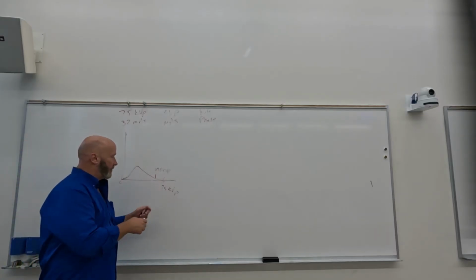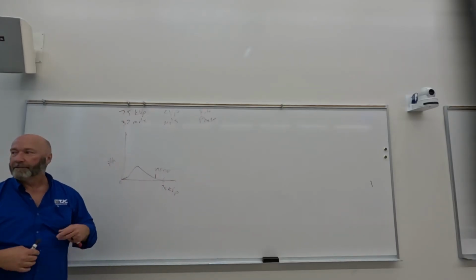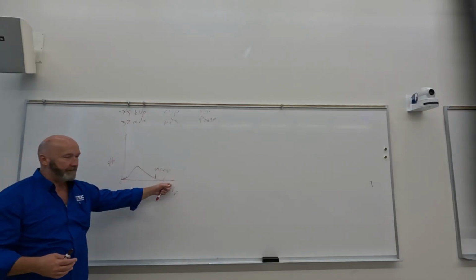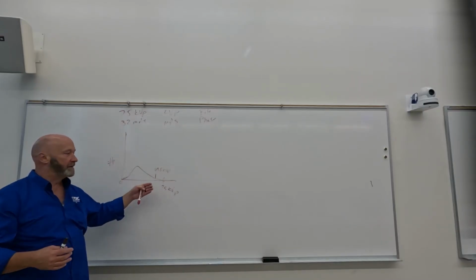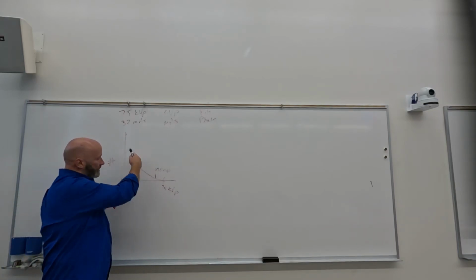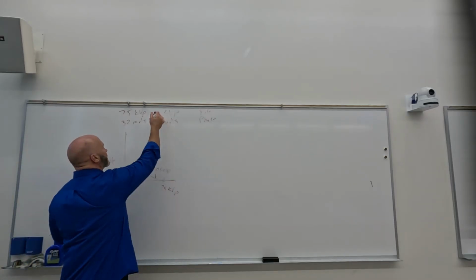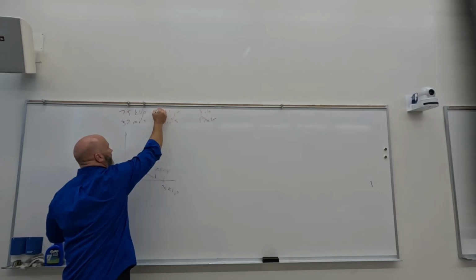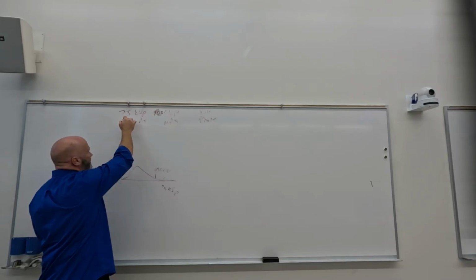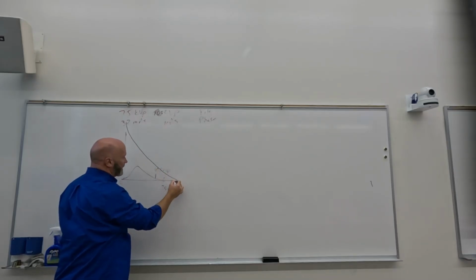If you increase your kVp, we have a tendency to think, okay, well, we're just going to add X-ray photons down there, right? That's not how it works. You can't aim the electrons at the nucleus of the atom. So what you're going to get is this same distribution that you had before. You're just going to have more of it. So if you change your kVp, we're going to leave our mAs the same, and we're going to make it more obvious, 100 kVp. Then our beam spectrum is going to start up there, and it's going to come down, and it's going to hit 100 kVp down here.